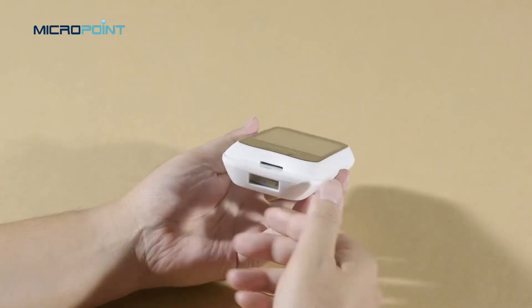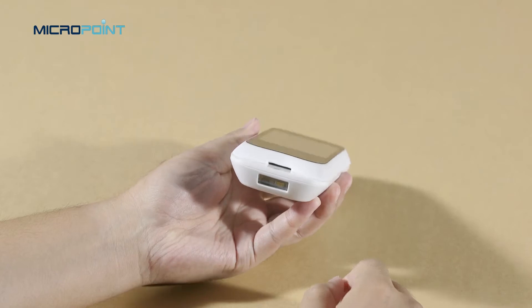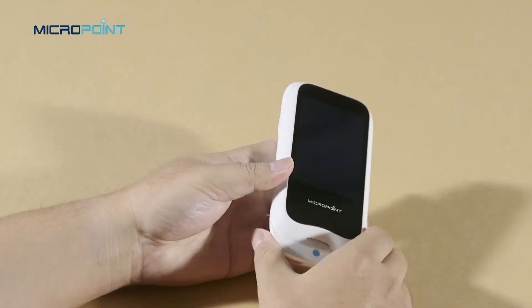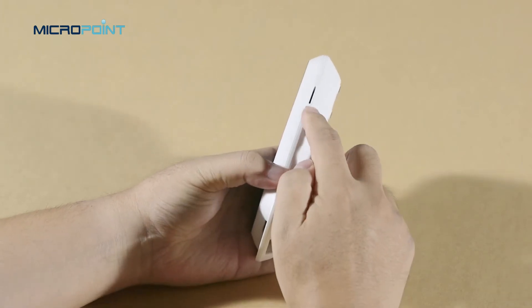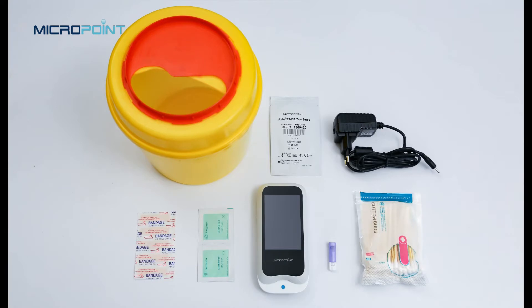For the plus model, on the bottom, you will find the scan module. On the left, you will find the power button, and on the right, the code chip slot where the code chip will be inserted to install before the test.